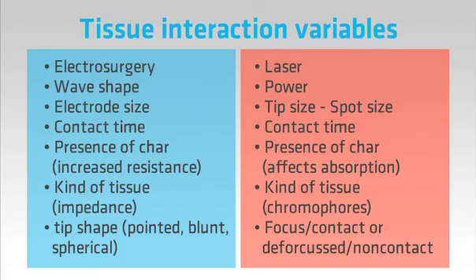With electrosurgery, the collateral injury is deep in the tissue and hard to see. With the laser, we see what is happening on the surface and use that information to guide us. With electrosurgery, charring and carbon increases impedance and slows down cutting. With the laser, charring and carbon absorb laser energy, and they also slow down cutting.